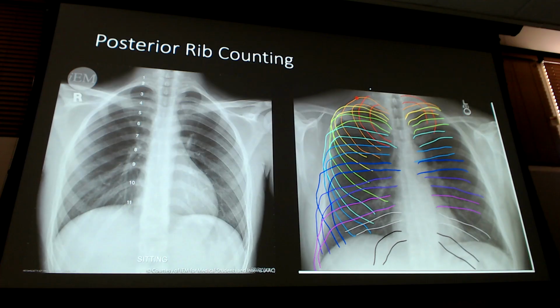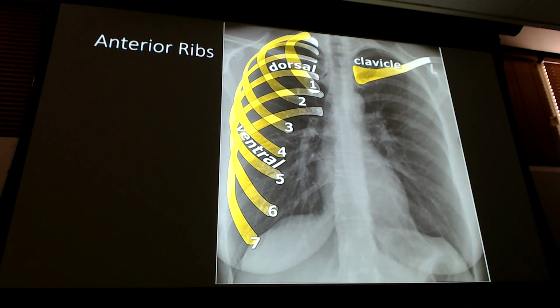So if you remember the shapes of what the ribs are supposed to be, and then try to use your anterior to start you off to make sure you're starting off at a good number, you can count down that way. Right? Now, we draw your attention to one other thing, and then we'll go on a break. Okay? Notice where anterior rib 7 is.